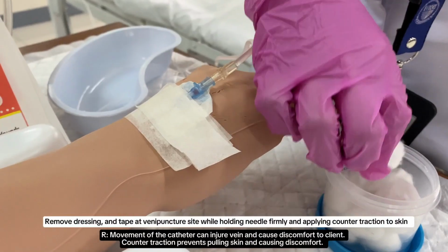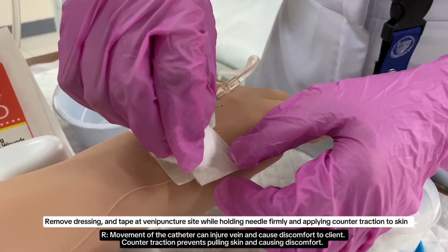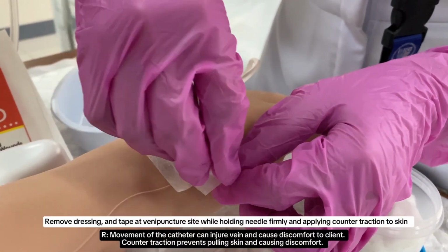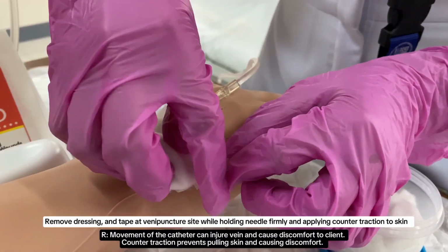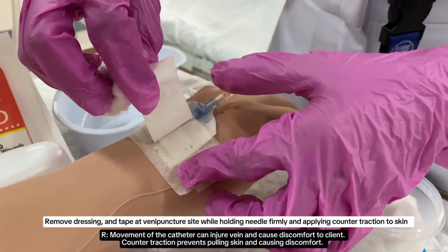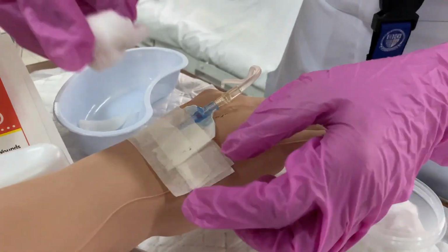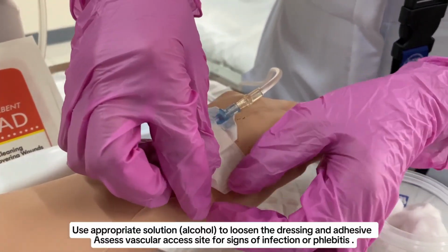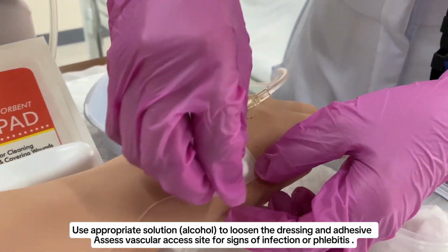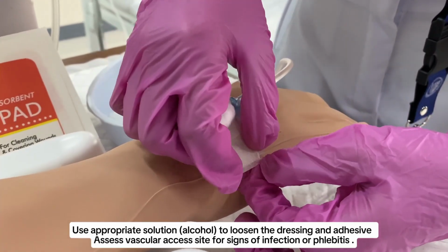Remove dressing and tape at the venipuncture site while holding the needle firmly and applying counter traction to the skin. Movement of the catheter can injure the vein and cause discomfort to the client. Doing the counter traction prevents pulling skin that causes discomfort. Use an appropriate solution like alcohol to loosen the dressing and adhesive. Assess the vascular access site for signs of infection or phlebitis.